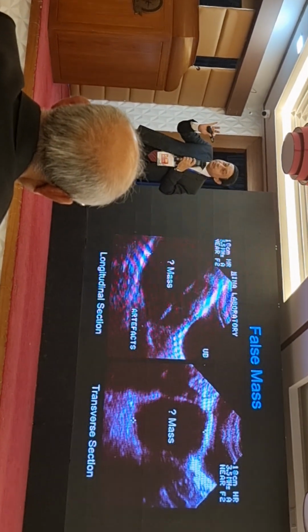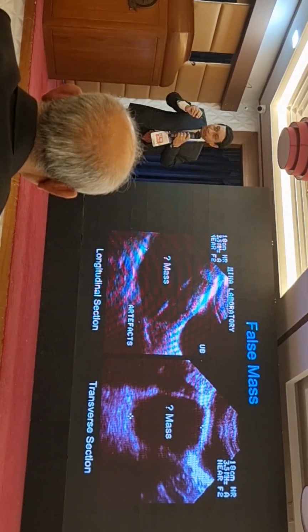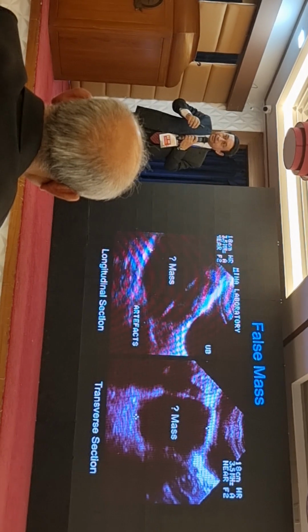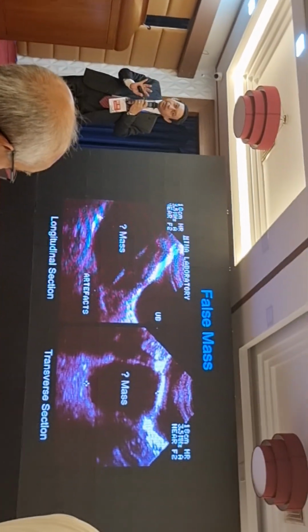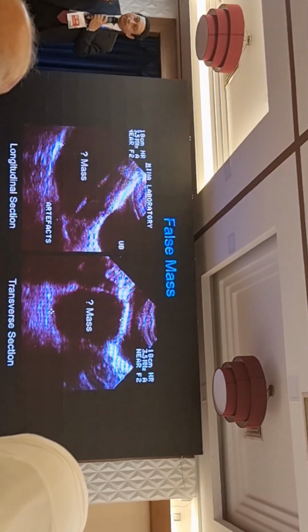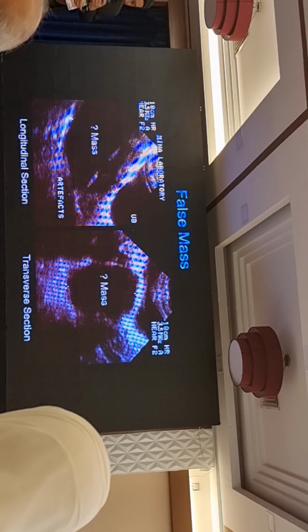Even then, sometimes we can give some preparation to the patient and ask the patient to come the next day. So in this way, we can avoid this sort of artifact. But first of all, there must be a high grade of suspicion.